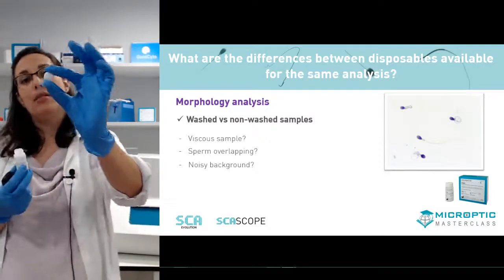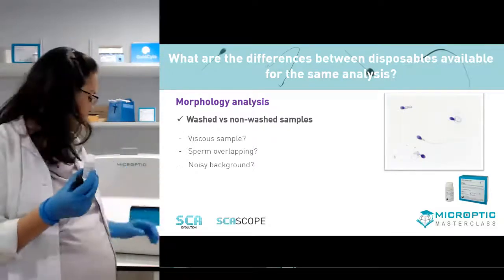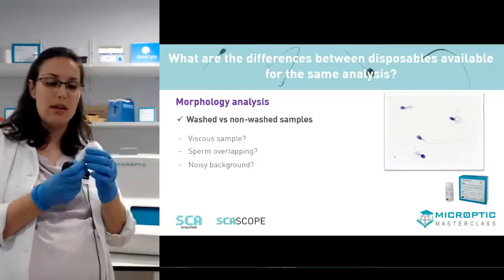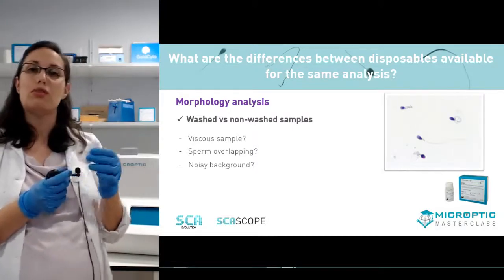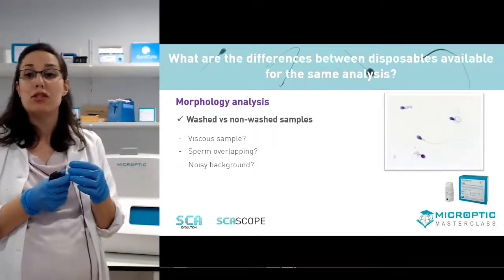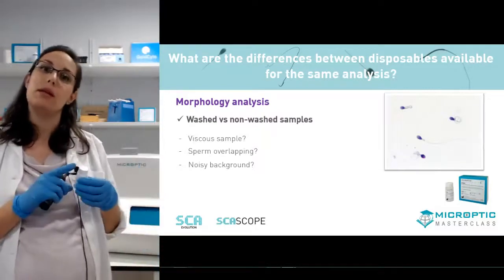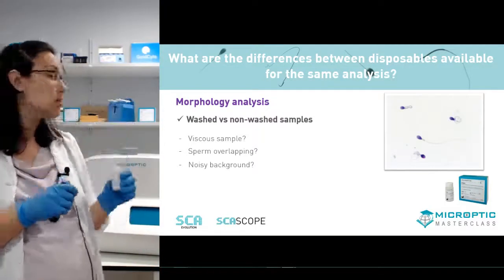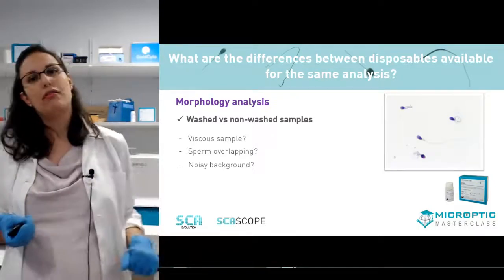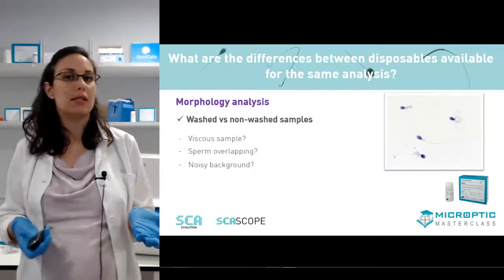These are provided as pellets that can be stored for long periods of time at room temperature, don't require specific storing conditions, and you can dilute each tablet in 200 ml of deionized water and use it for simple washing. Okay, you can just centrifuge the sample and replace the seminal plasma with PBS. That way you will minimize all this noisy background that could overstain our semen sample.